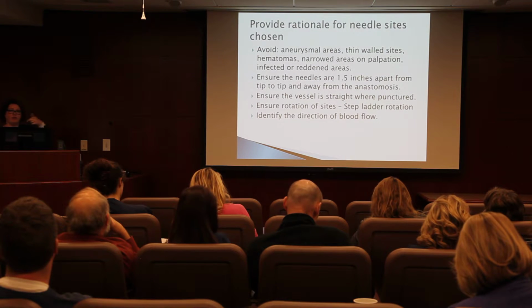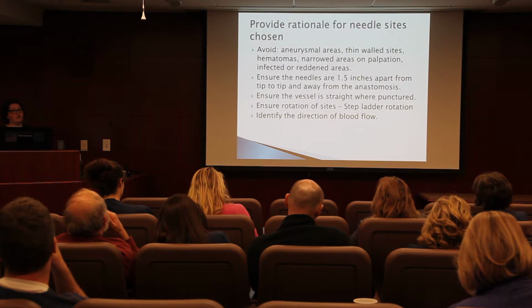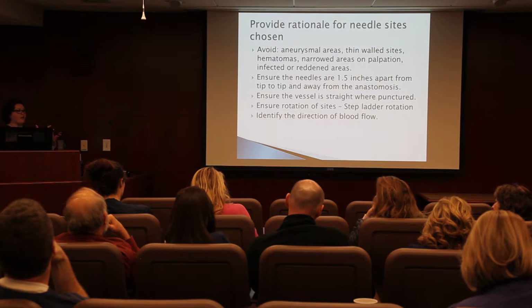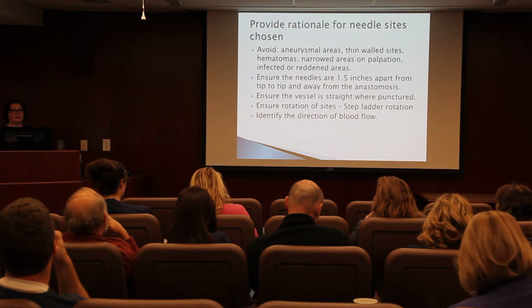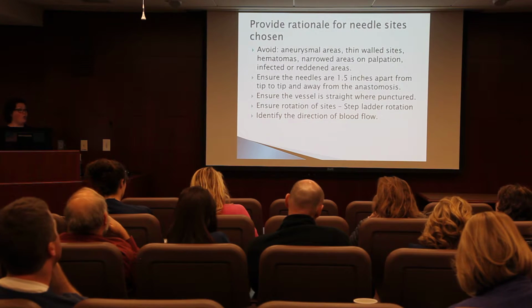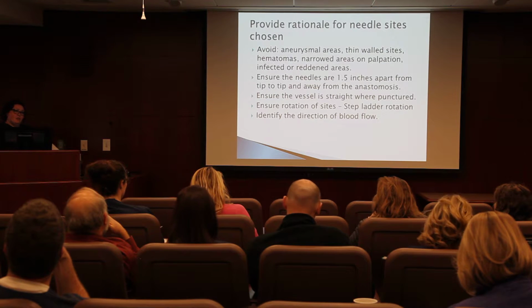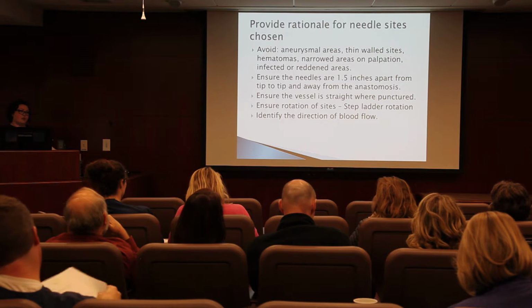We do get some very tortuous vessels, and unfortunately when the surgeon goes in to create this fistula, they don't know how that vein is going to be until they actually make the connection, and the patient comes back in a month and sees us, and we're like, whoa. So sometimes you only have short little segments to put the needle. So you want to try to go where the straightest part is.